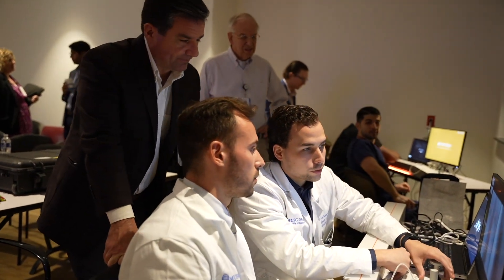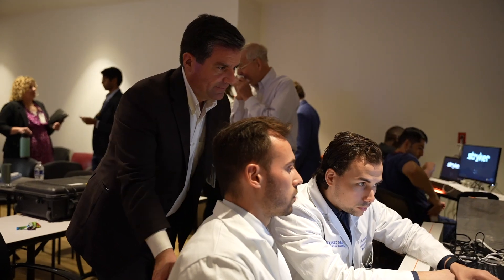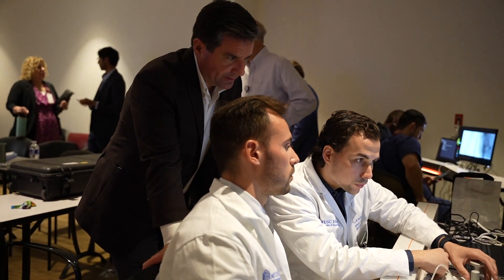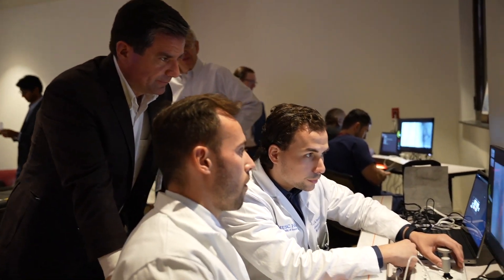Good. Put the catheter right where you think it will be. Rotate it once. Switch your hands over. Please. Rotate once and push the whole thing out. Put your hot hand, Josh. Put the hot hand. Beautiful.